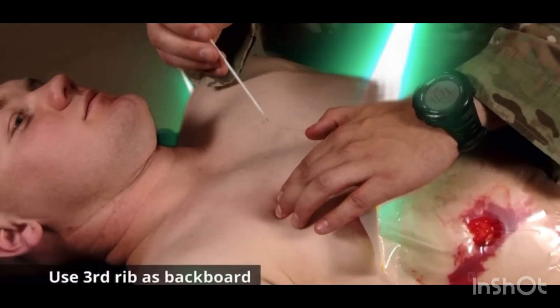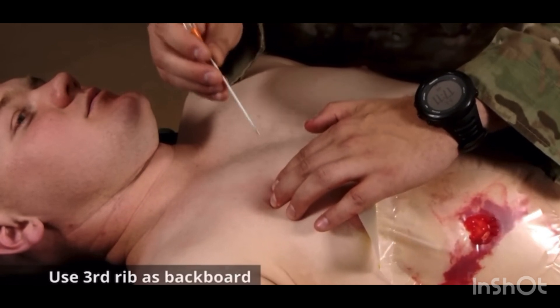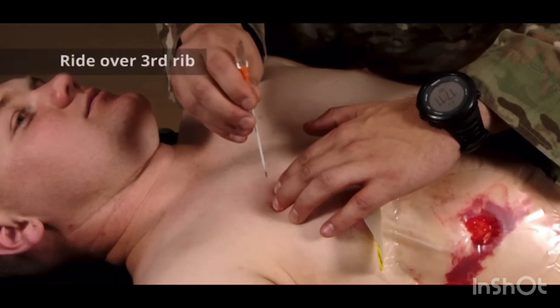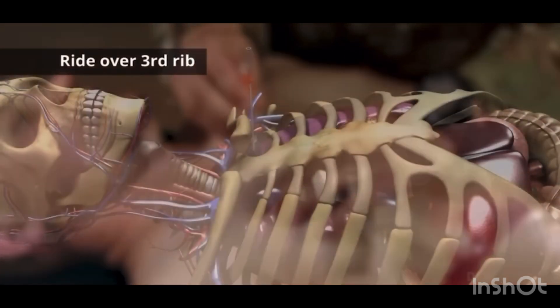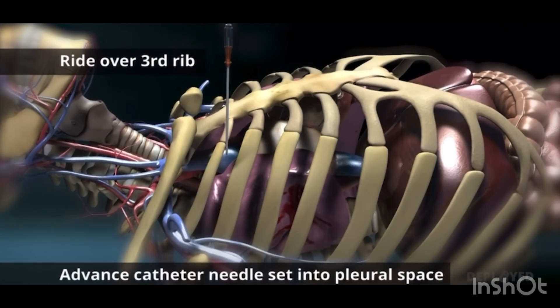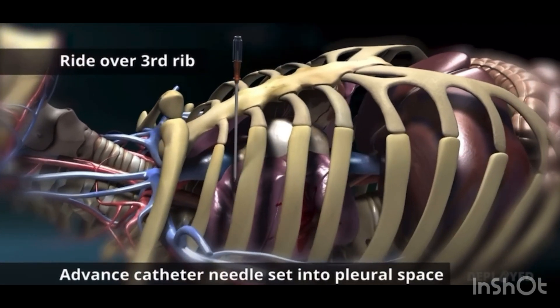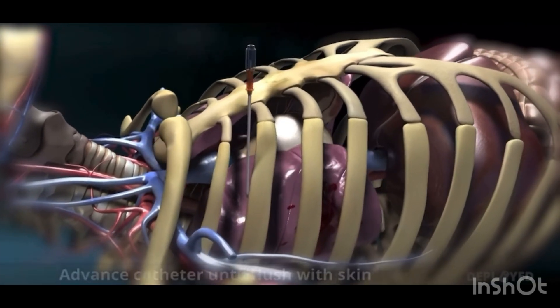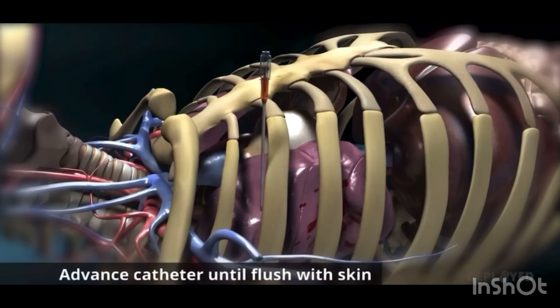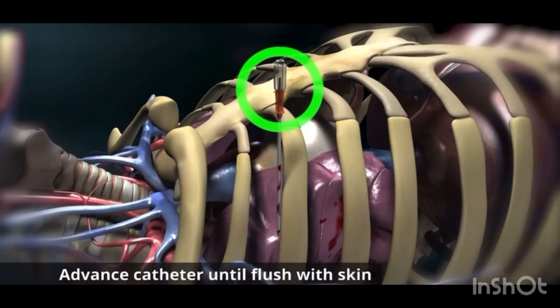Step 2: After cleaning the insertion site, use the third rib as a backboard and enter the chest wall at a 90 degree angle. Advance the cannula into the pleural space, and once you've entered the pleural space, advance it until you're flush with the skin.